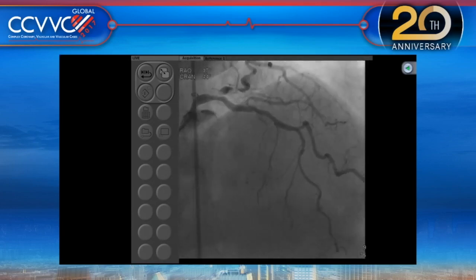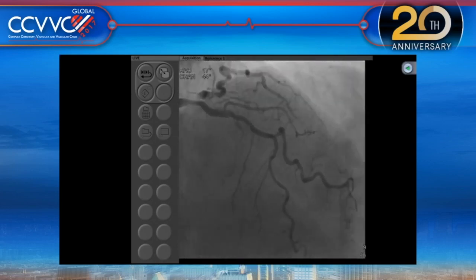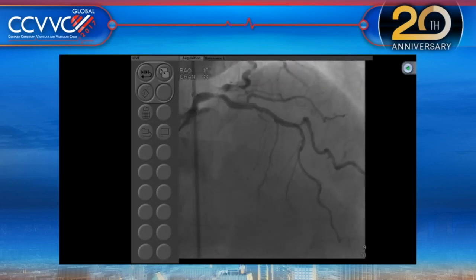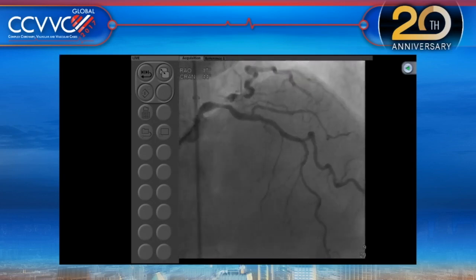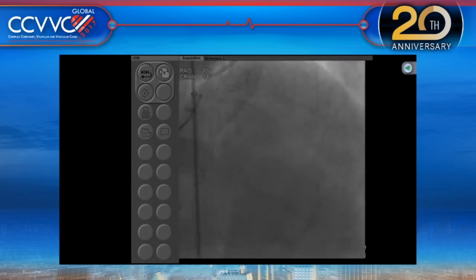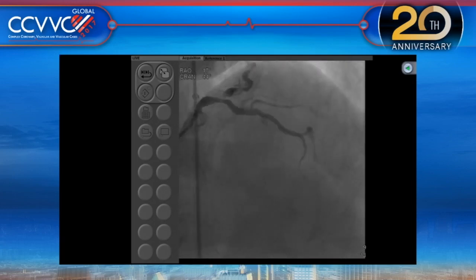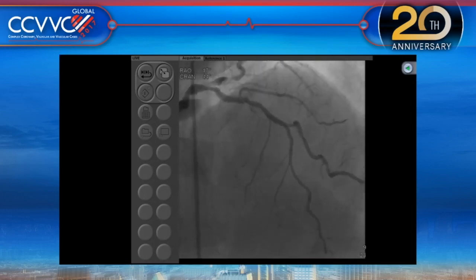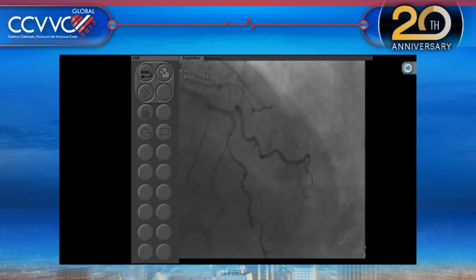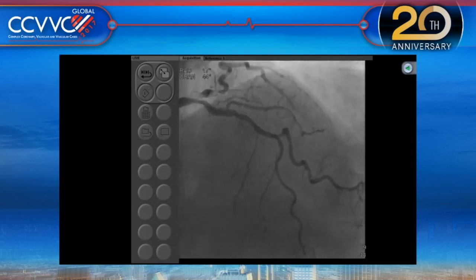Yeah. So I see you already put a balloon pump in. Tell us your reasoning. What actually happened is when we saw the angiogram from the outside hospital, it was a different looking circ. But in the last couple of days when we saw this angiogram, she has distal left main and a calcific, almost total circumflex, and that's when we thought this is an angulated circumflex. If you have difficulty in wiring, especially if you have a vessel closure when you're wiring, she will need balloon pump assistance. So while we were waiting, we thought we would have a prophylactic balloon pump.